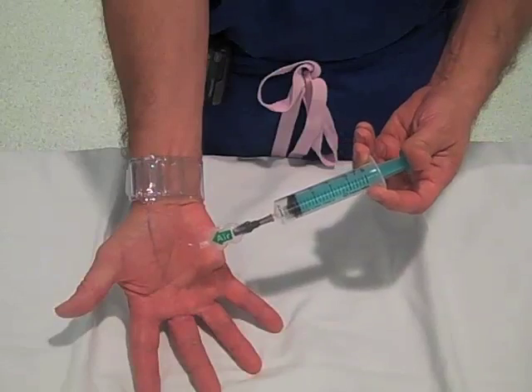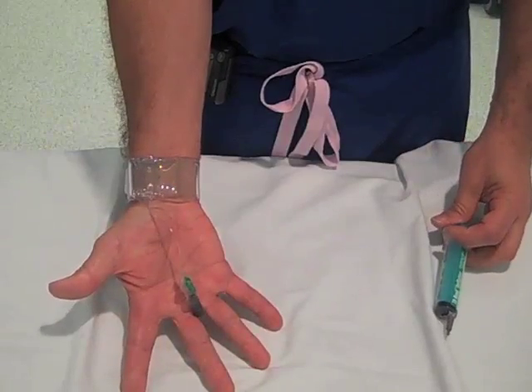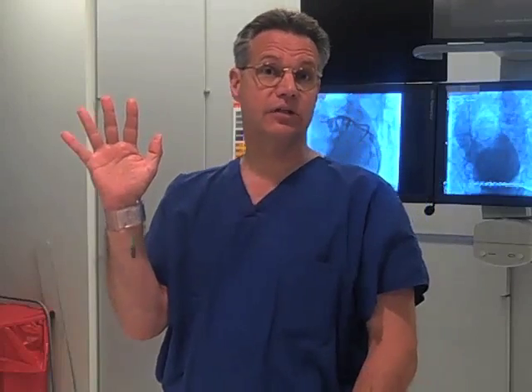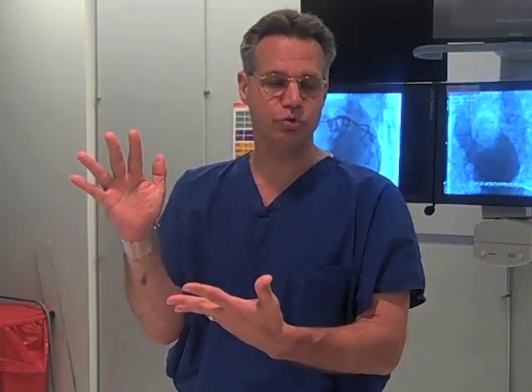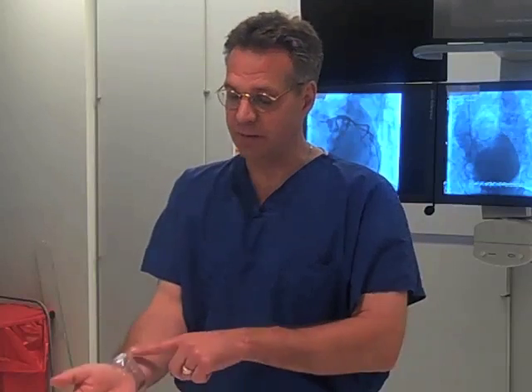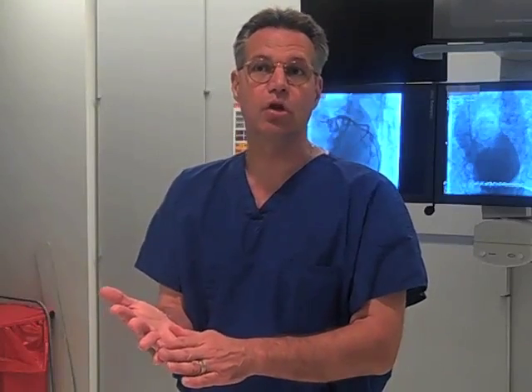And the bladder is inflated right over the arterial puncture site. The line is removed. This remains in place then for the next couple of hours. The volume within the bladder can gradually be decreased, and ultimately then is removed before the patient goes home. And so it's really quite comfortable. You've got motion in your hands and fingers. At the same time, you're providing subocclusive pressure at the arterial site. And that's really an advantage because it prevents any issues of loss of pulses into the fingers and hands.